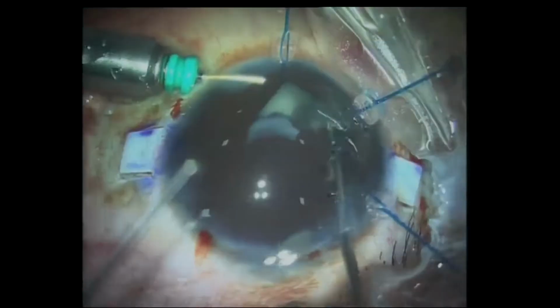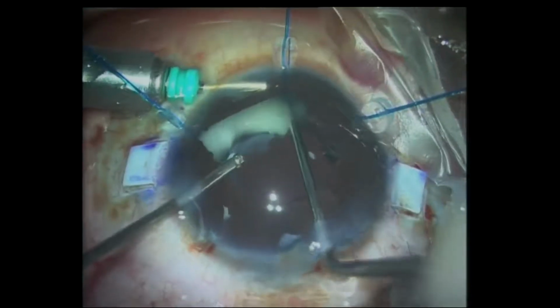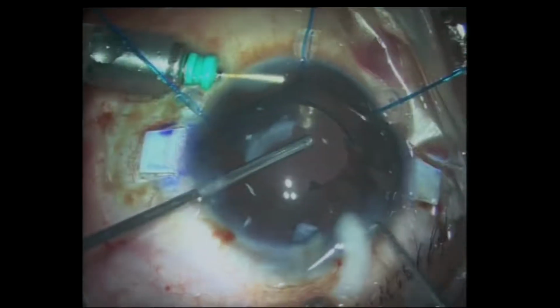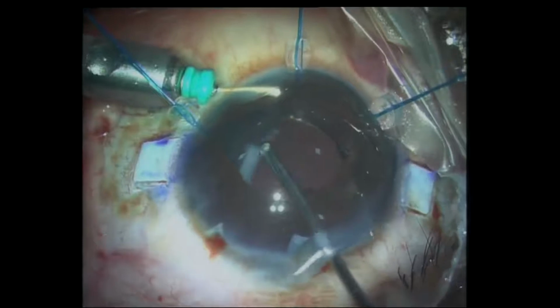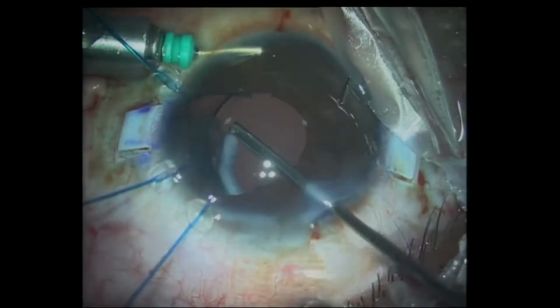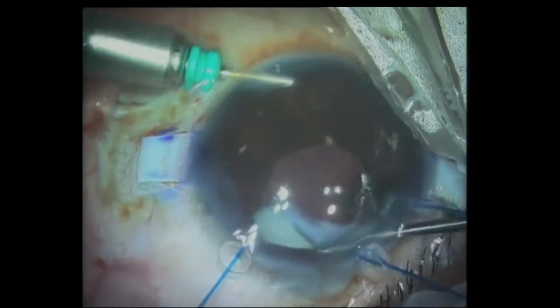So that's one technique. You can do that with smaller pieces in a longitudinal fashion, which are there currently. The smaller pieces do come out just by the burping technique using the pressure gradient. So basically the point of least resistance is where the piece will try to come out. If your point of least resistance is south, it's going to go down south.